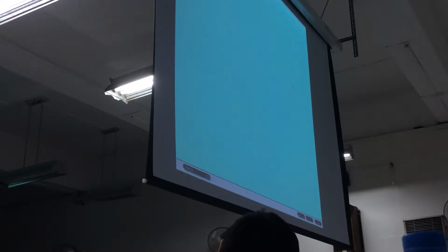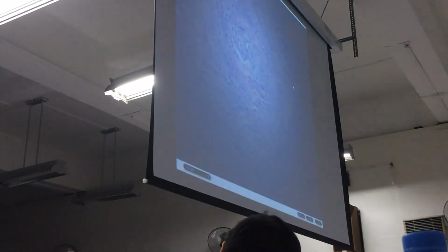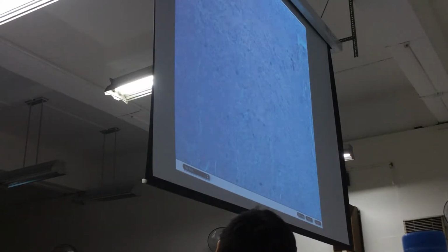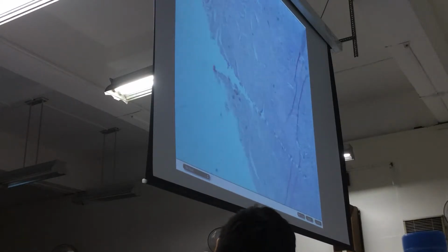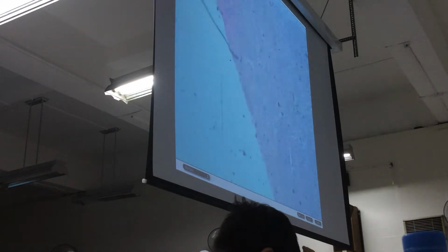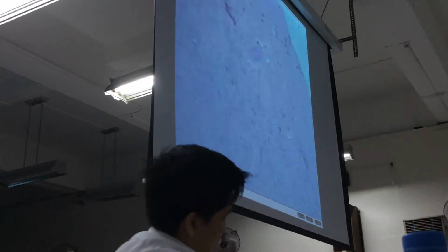I don't have M1004, so let's immediately go to M1007. M1007 likewise shows the uterus, however, it is focused on the cervix uteri rather than the body of the uterus, or the corpus uteri.